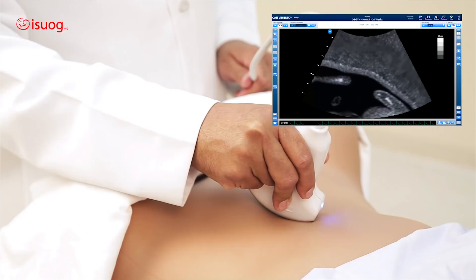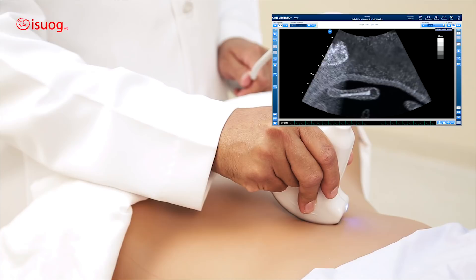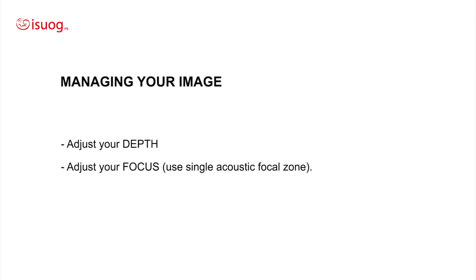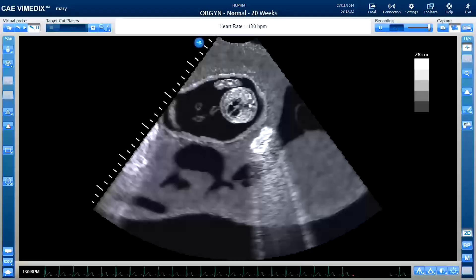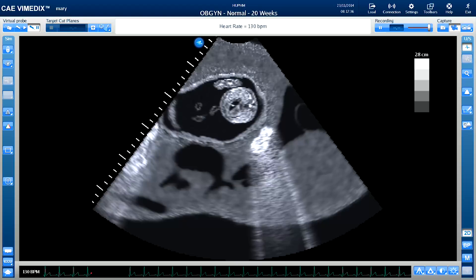It's very important to improve the quality of your image, and you do that by managing your image — mainly by adjusting the depth, adjusting the focus, adjusting your zoom, and adjusting your gain. One of the mistakes is not using the proper depth. As you can see here, I am looking at the heart using a depth of 28 centimeters, where all the space below the fetus is wasted space. The first thing I need to do is decrease the depth to 12 — and as you can see, the quality of the image is much better.